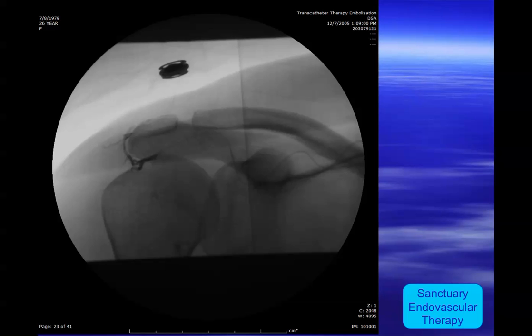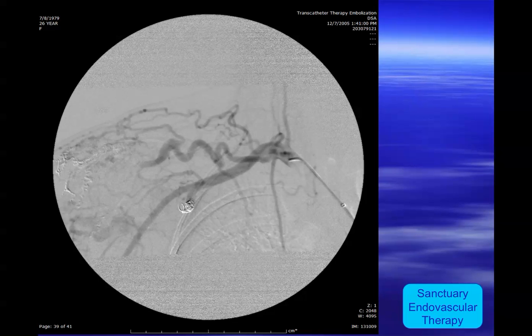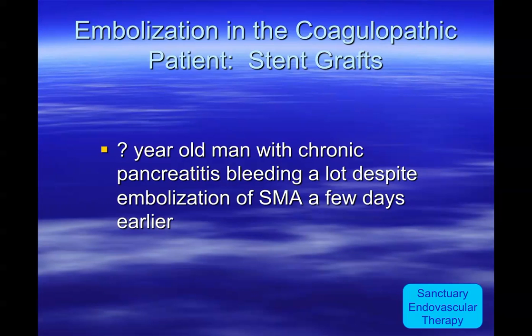And this is Onyx. And eventually she came back twice more for more Onyx and glue, and eventually all of those went away. This is old enough that I couldn't find the most recent examples, but I see her each year in clinic, and she hasn't required treatment in the last 2 years, so I'm hopeful that with the Onyx and the glue, we're able to hold that back down, and she has not yet formed another huge varix. This is even older, I believe.